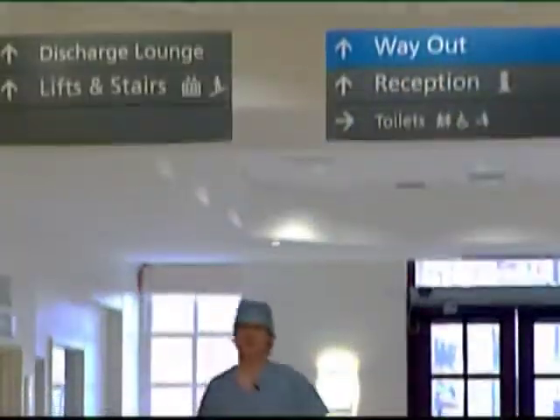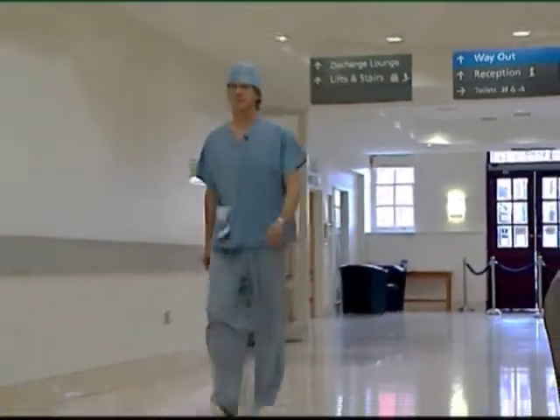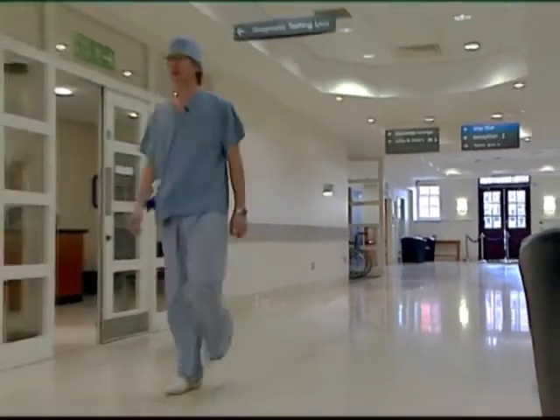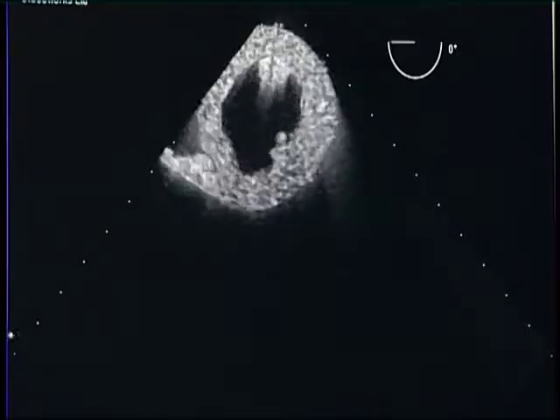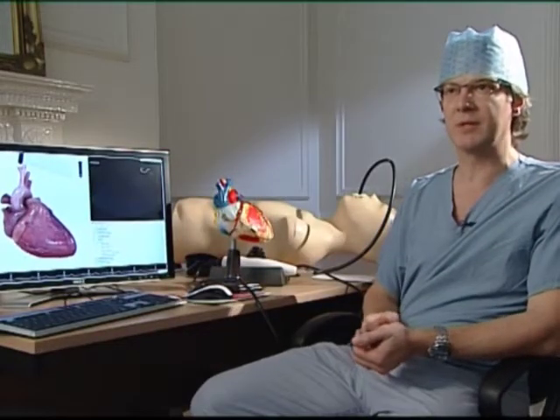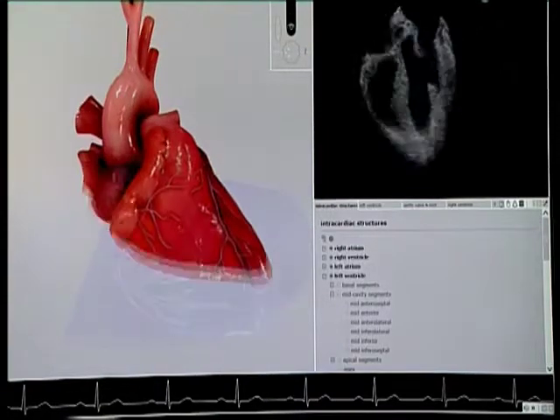At the London Heart Hospital, trainee medics can get a glimpse of the human heart without making a single incision into a patient. Transesophageal echocardiography is taking ultrasound pictures from the esophagus or the gullet at the back of the heart and producing 2D ultrasound pictures, much in the same way that when people have an antenatal scan of a pregnancy, we get similar sorts of images, instead of a pregnancy, of the heart taken from the gullet behind the heart. We use this quite a lot during cardiac surgery, and the cardiologists use it quite often to assess sick hearts, essentially.